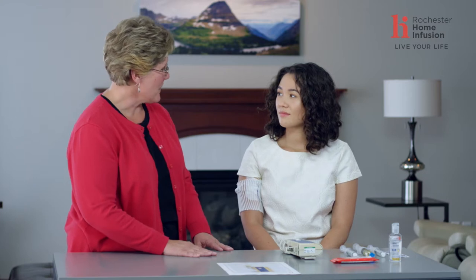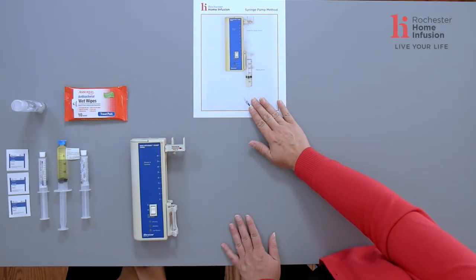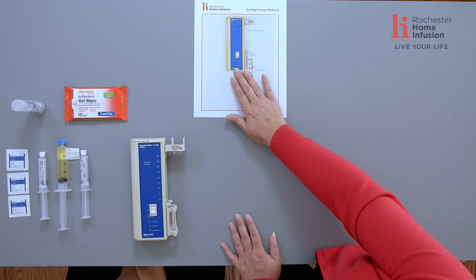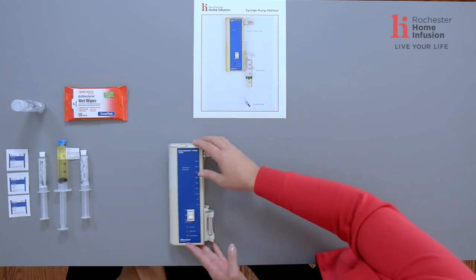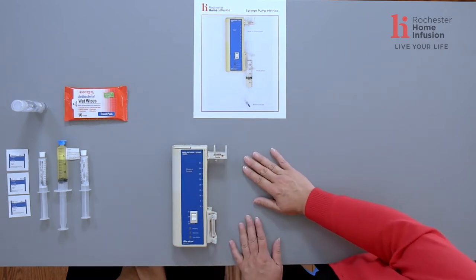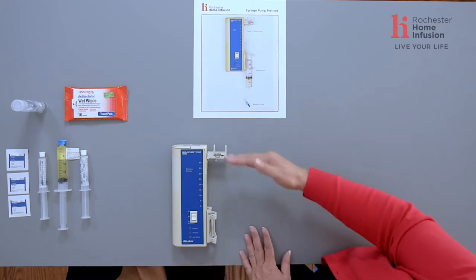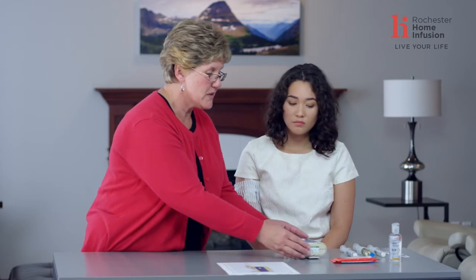Let's walk through your syringe pump administration. Here we have a picture of the syringe pump method that you went home from the hospital with. This picture shows us how to connect our syringe to the pump. This particular pump is used when we're giving medications in a syringe that are going to take anywhere from 15 minutes to an hour to infuse.